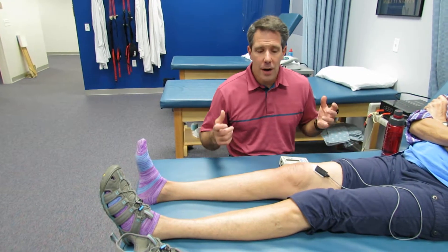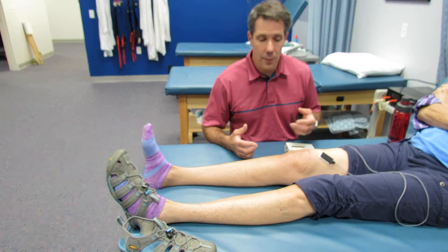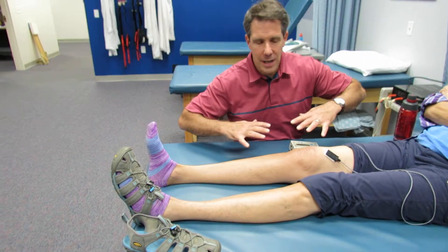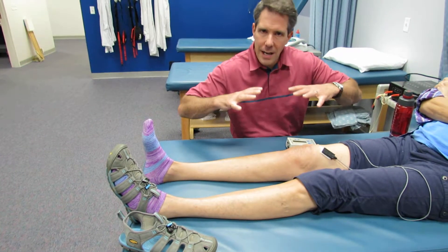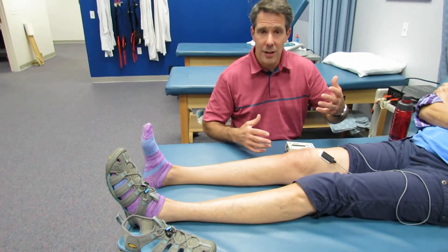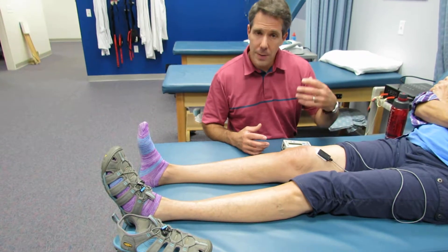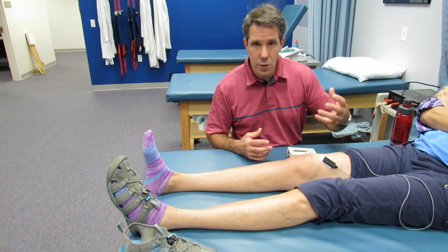Hey everyone, we are going to be talking today about how to obtain better active knee extension. We just did a ton of video clips on how to obtain good passive knee extension, but once you start to get close to getting that knee extension, you really need to activate the quads. One of the ways we like to do that is through biofeedback so the patient can actively contract their quad a little bit better.